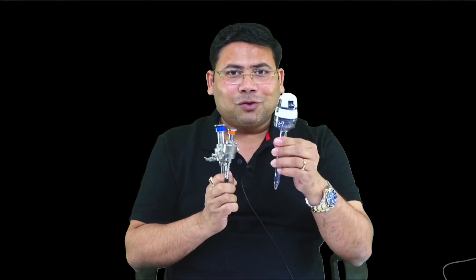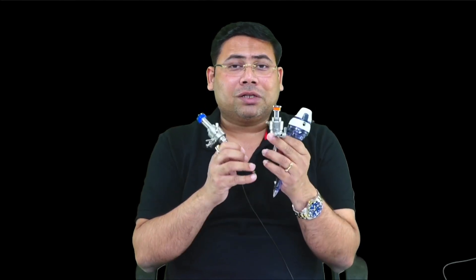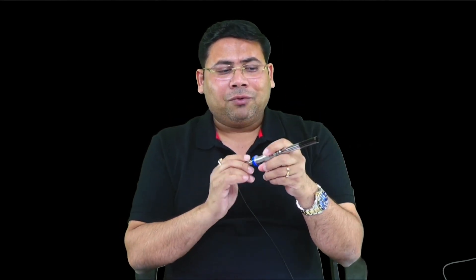The second instrument is a port. A port is a combination of a trocar and a cannula — trocar plus cannula is known as a port. There are a lot of types of trocars and a lot of types of cannulas.